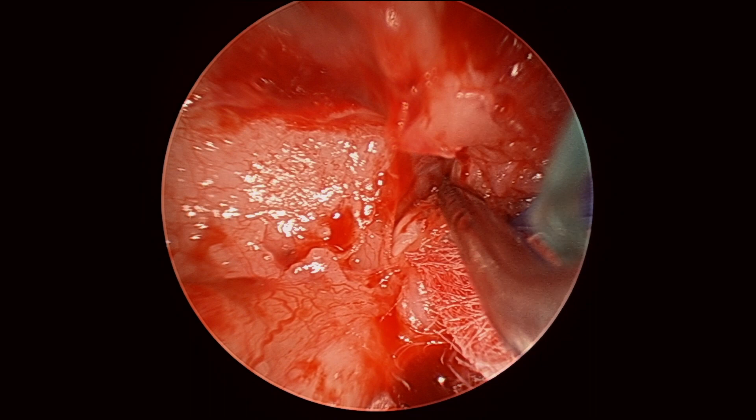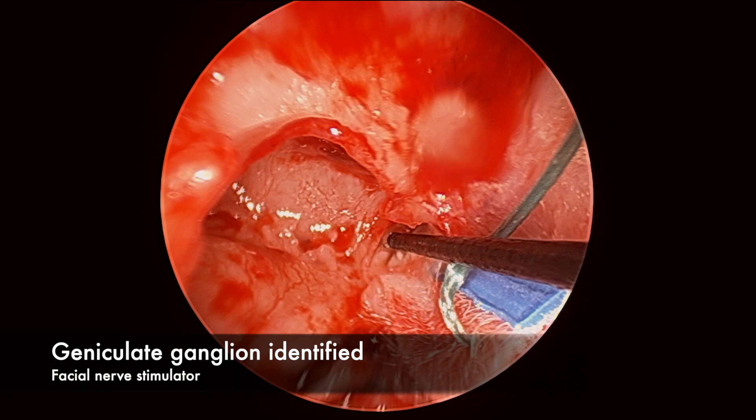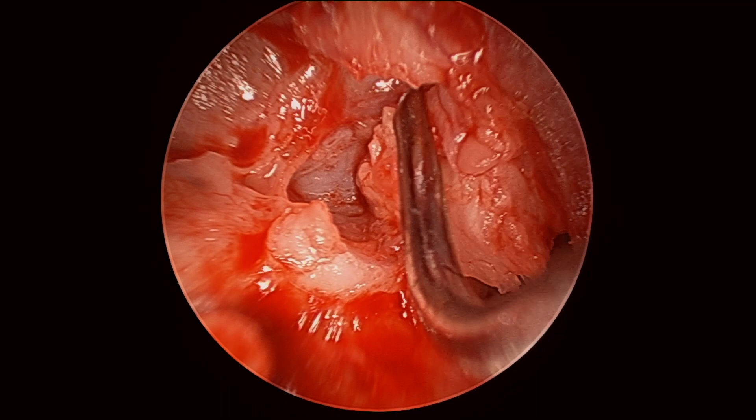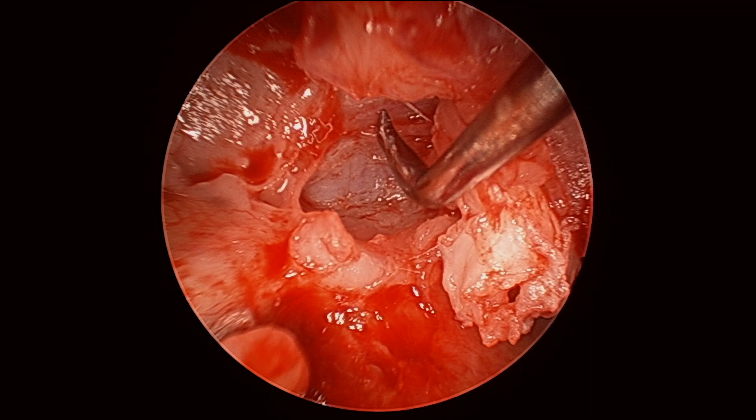The geniculate ganglion is being identified with the facial nerve stimulator, and here is the example of using the small round knife in front of the bony aspect of the cochleariform process. Instruments progressively are used, with the medium Thomassin being used to confidently clear the disease off the middle cranial fossa and around the geniculate ganglion region just here.